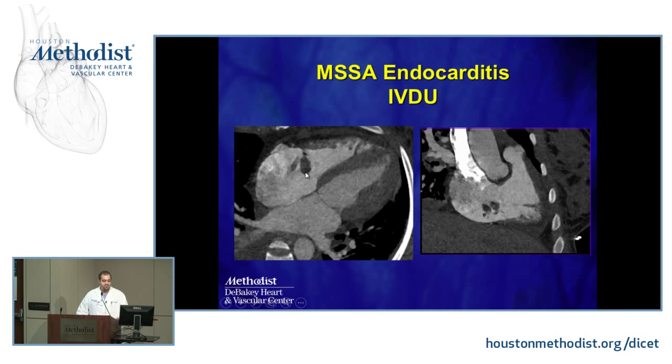I guess everyone, maybe even at the end of the hall, can appreciate that you have this large hypodense mass that's basically attached to the tricuspid valve. This is a young patient with IV drug use and documented MSSA endocarditis.